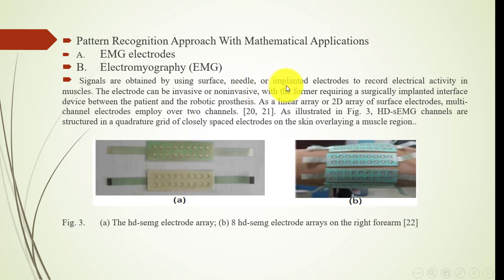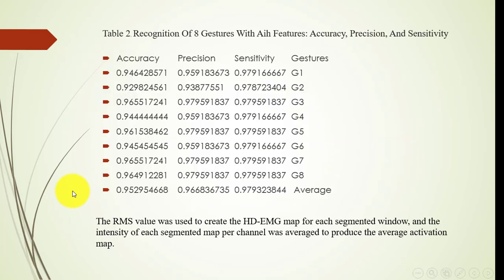surface electrodes implemented to record the electrical activity of the muscle. This is the electrical activity used for recognition of the different objects, as shown in figure 3, where the recognition of our system will have average sensitivity for our technique, compared with other techniques from other researchers.